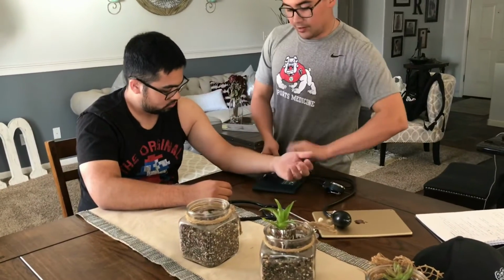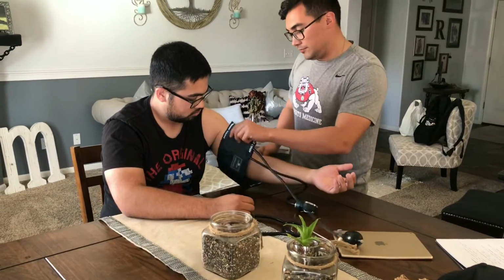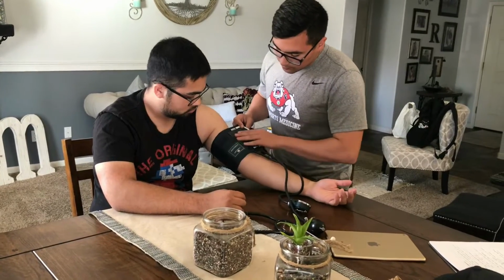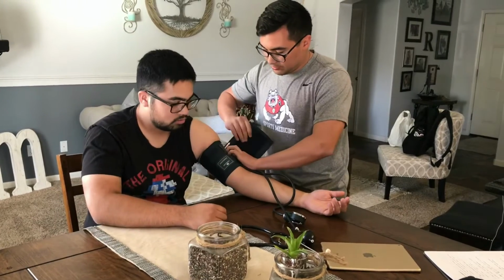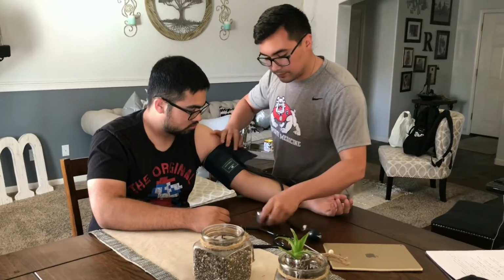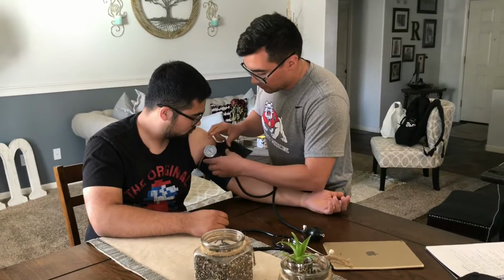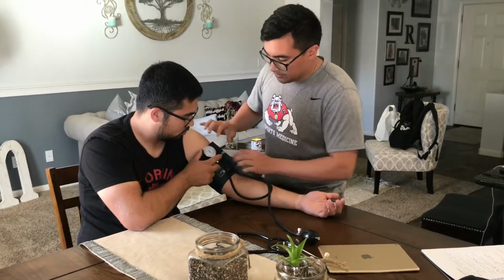I found it. Now what we're going to do is find the little artery marker on the cuff, and line it up right there. About right there. And I'm going to grab this and wrap it as tight as I can. And I'm going to grab the marker here and slip it in right here so I can look at the millimeters of mercury I am pumping.